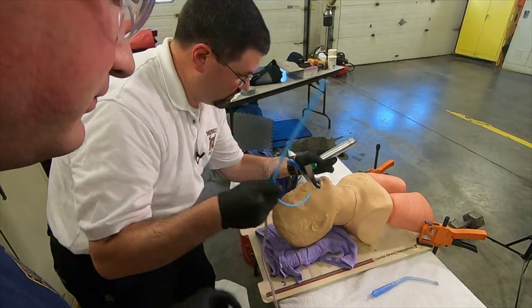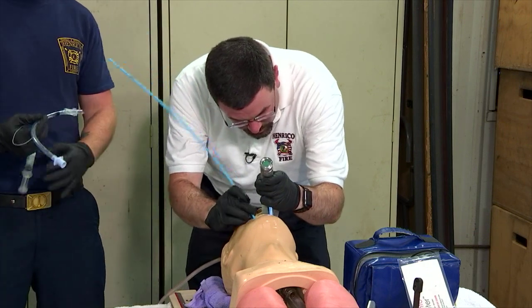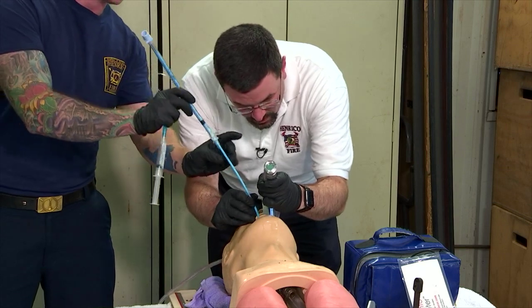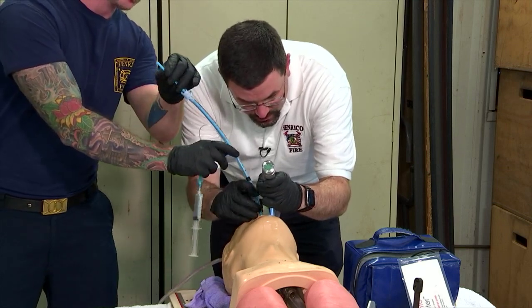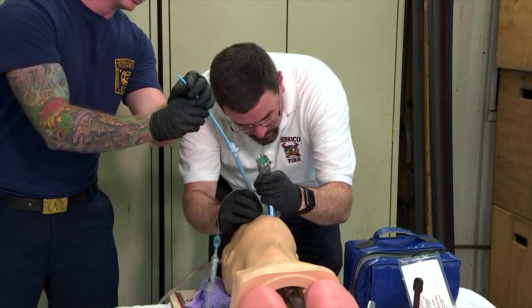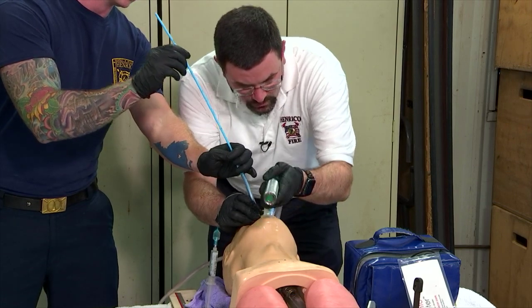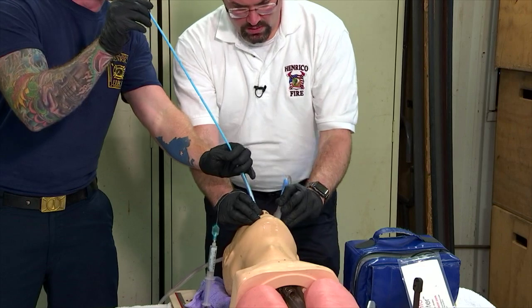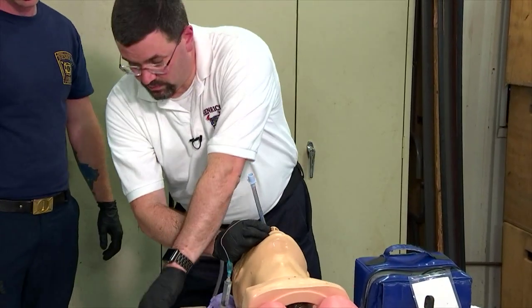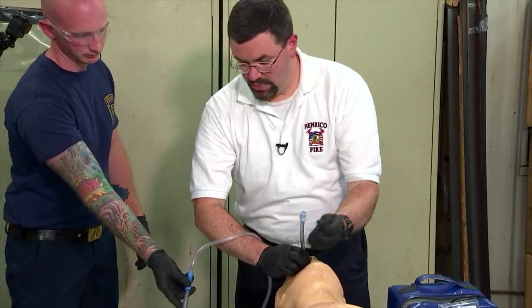Bougie, please. Thank you. And Peter, if you'll load my tube onto the bougie. All right, tube's coming. Thank you. I have the tube. You have the bougie? Okay. Bougie out. All right, bougie's coming out. Go ahead and take it out. All right, the bougie's out, and then I can remove my catheter or leave it in until I get my cuff inflated and begin to bag.